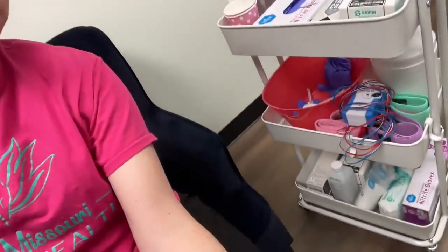So we use acupuncture needles, and I have my little needling cart here. You can see all the fun things. It uses acupuncture needles, which means it is a monofilament needle. Rather than when you get your blood drawn or get an injection, those needles have a hollow space in the middle of them to allow exchange of fluid, either drawing blood, pushing medication in, an IV, whatever. So they're thicker. The monofilament needles are just one single piece of steel, so there's no hollow space in the middle, so it's much smaller, thinner, and it doesn't feel nearly the same as when you get an actual injection.